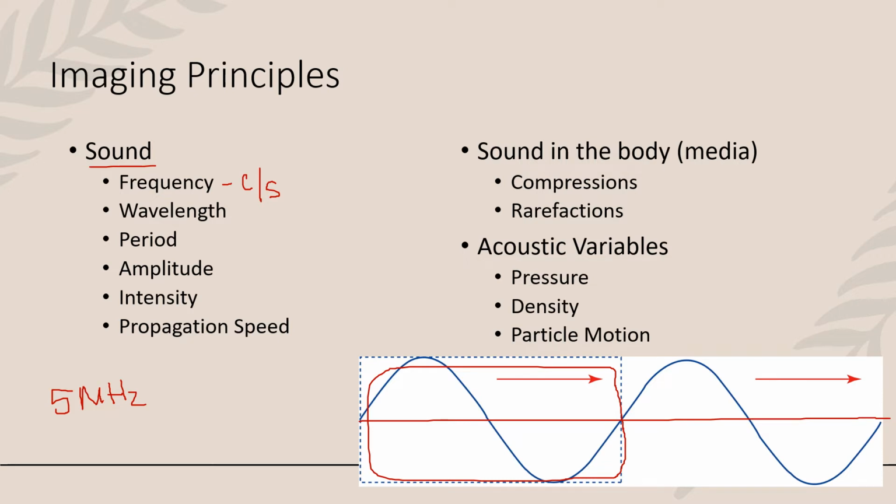Secondly, when we're looking at our sound waves, if our frequency is known for telling us how many cycles per second, the wavelength is known for telling us the distance that cycle takes up in space. So the fewer cycles I have per second, or the lower my frequency, the longer my wavelength becomes. If I have a decrease in frequency, I have an increase in wavelength. And vice versa. If I am able to shrink my wavelength, making it much smaller, I'm going to be able to accomplish many more cycles per second to increase my frequency.